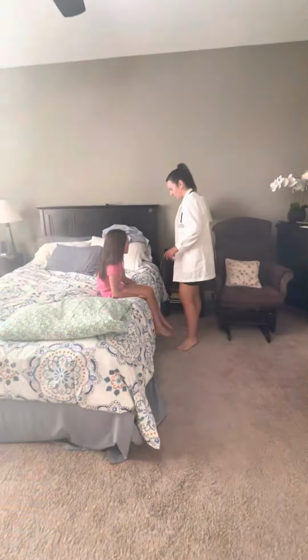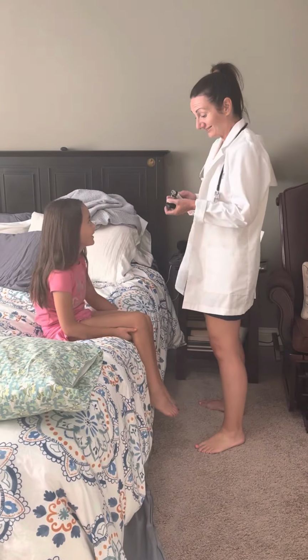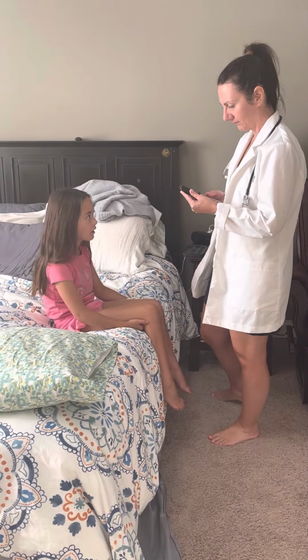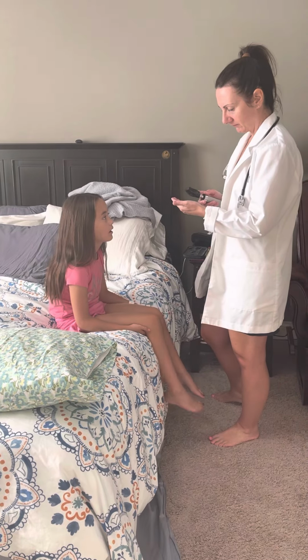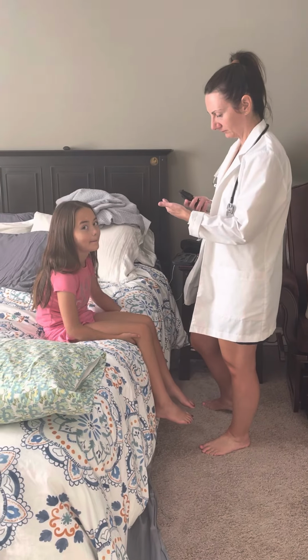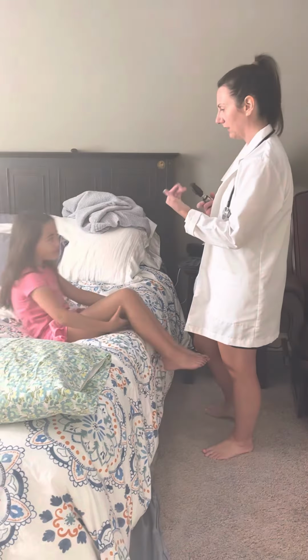And then we would take the otoscope and put it together. Okay. Sit up, honey.